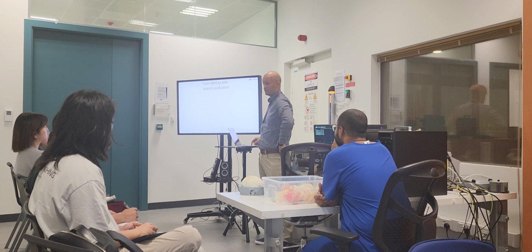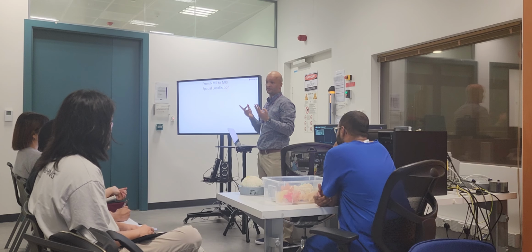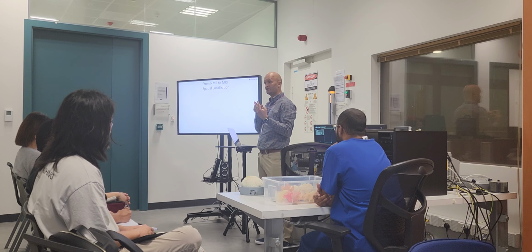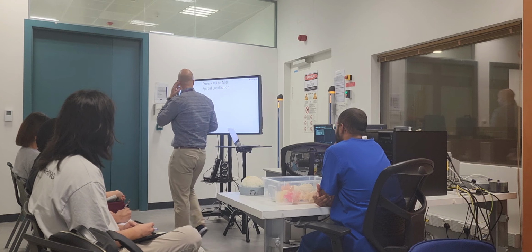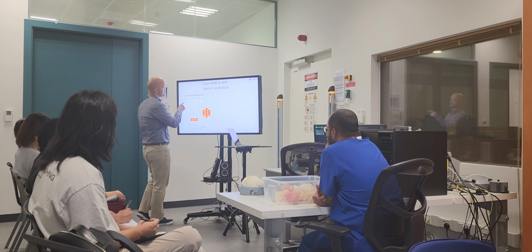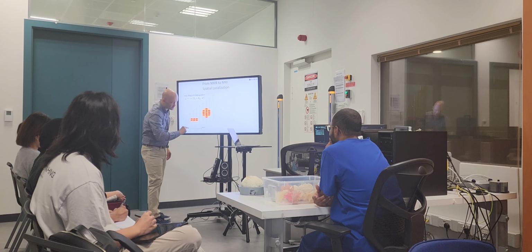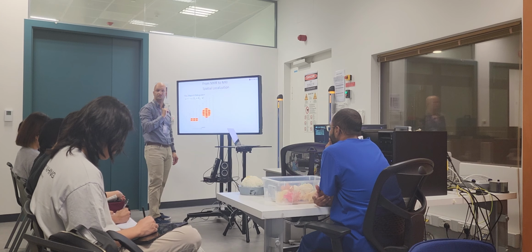How do we do spatial localization? We add a new magnetic field. So far we have the B0, the strong magnetic field, the radio frequency, the B1, and now we added a G, gradient. And the gradient affects the Larmor frequency in a known pattern. So let's say I have an X gradient along the x-axis. I just taper my magnetic field slightly, in the order of milliteslas.